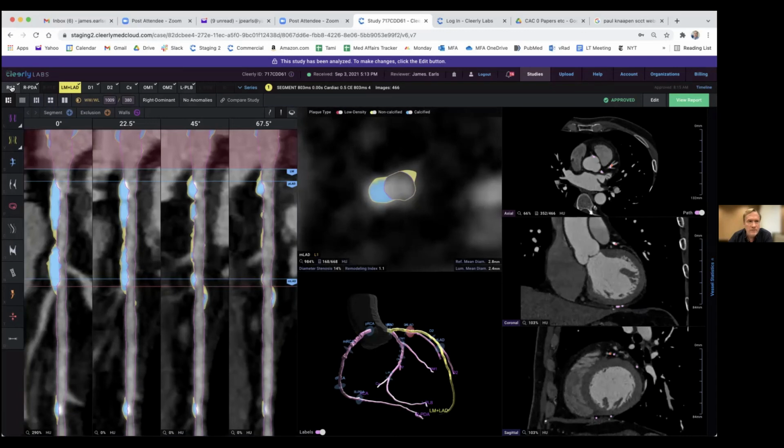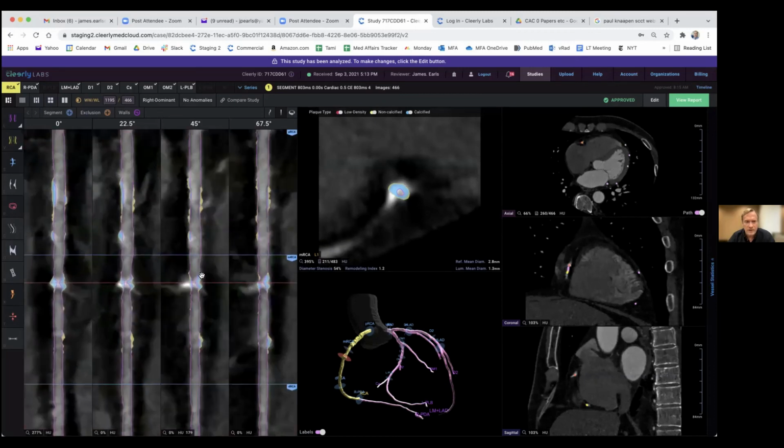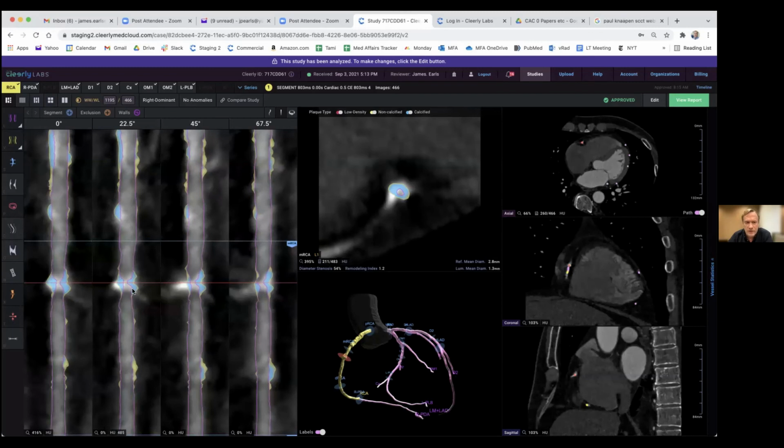They do have a much tighter calcified plaque in the RCA. In this case, if we look down here in the mid RCA, we see a predominantly calcified plaque that is a very short segment, with a little higher stenosis that goes along with it. We just had the Clarify 2 study accepted at JACC Imaging, in which we compared 300 patients with quantitative coronary angiography as well as FFR. What we did find is that our ability to use machine learning for the issue of stenosis specifically really helps us in terms of overall accuracy.